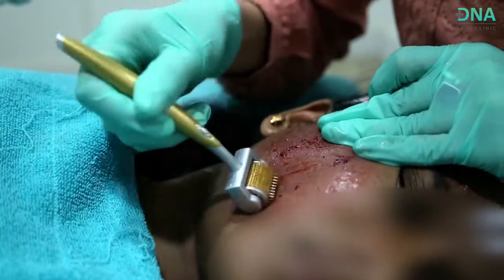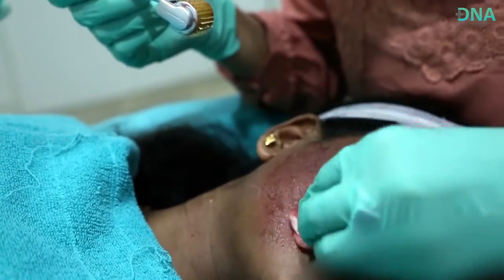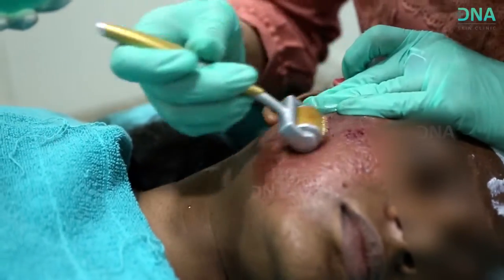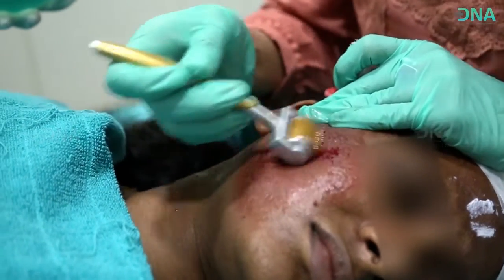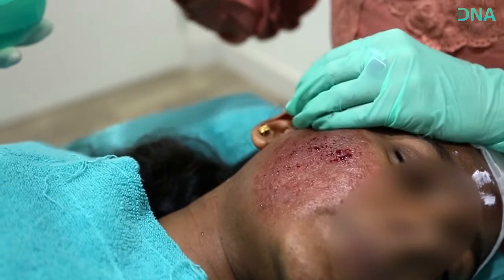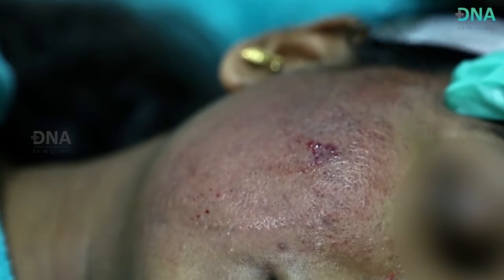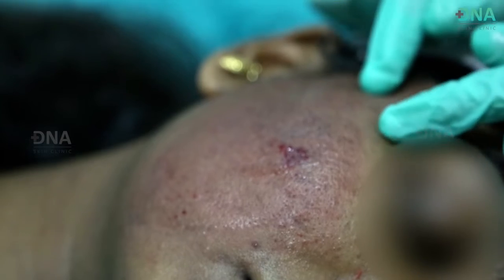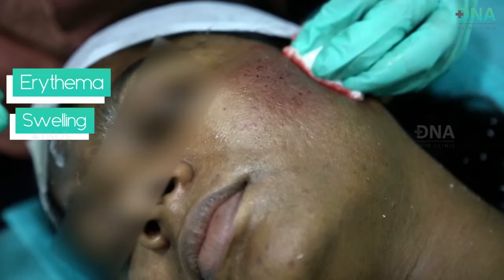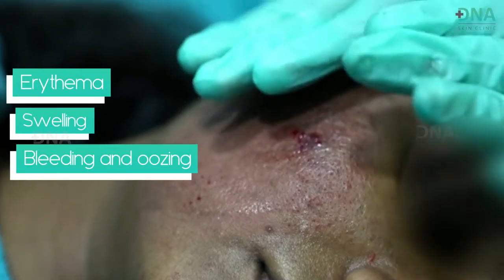Today is a lucky day for us because we have a very cooperative client. Without sugarcoating, to be very transparent to the viewers, Dermarolling is a little painful procedure. In spite of applying the topical anesthetic, it can be a little painful. Immediately post procedure, if you can see, there is a little bit of erythema or redness on the treated area. There is mild swelling. There is bleeding and oozing. All of this will subside and the skin will be back to normal in a couple of hours.